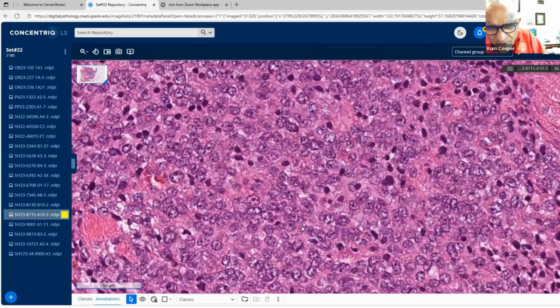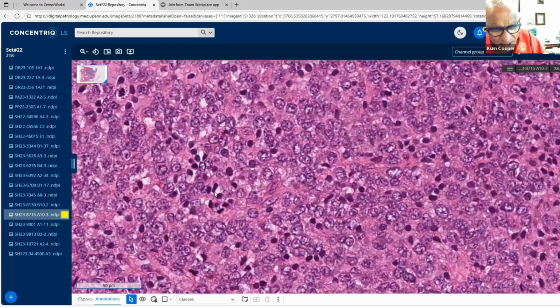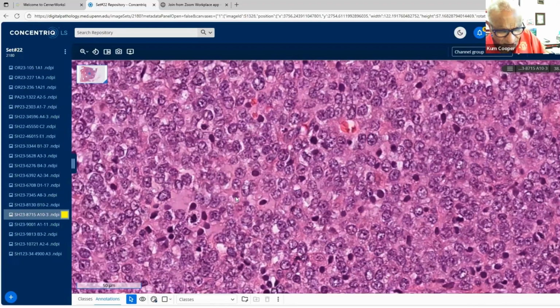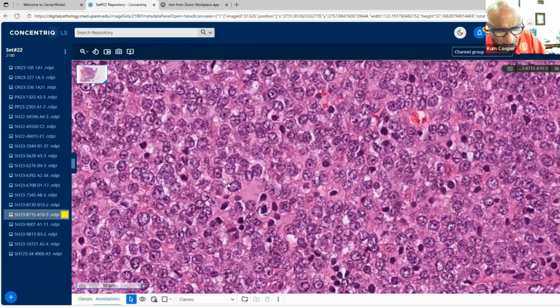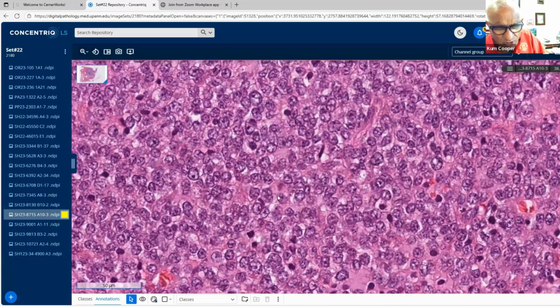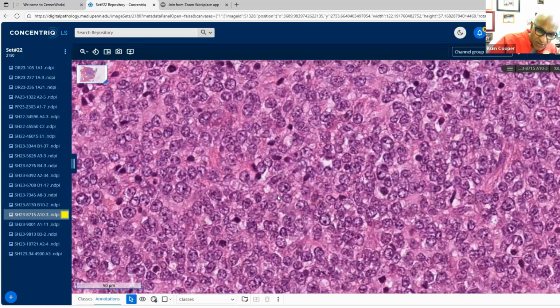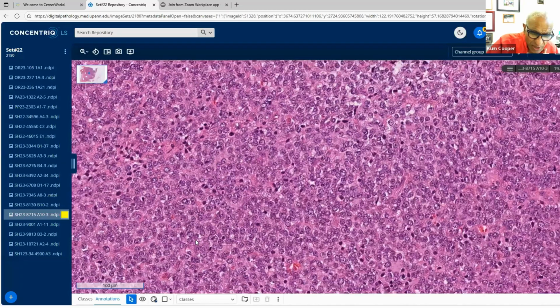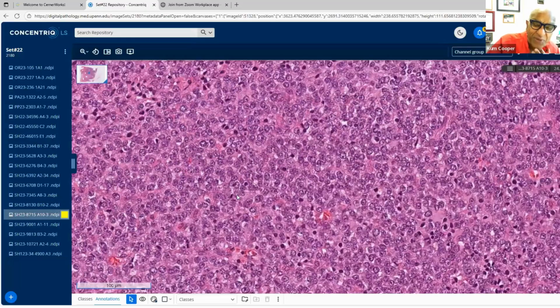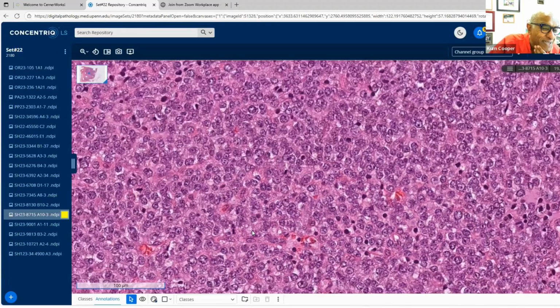What makes me think of myeloid sarcoma when I'm looking at these cells on high power? That's a very, very good thought, is to look for the eosinophilic metamyelocytes. Those are immature eosinophils with single nucleus and the granules. And that's the one I've always found to be useful, particularly outside of the bone marrow. I don't do hempath, but we do get these that might look like one. That's a very good thought.